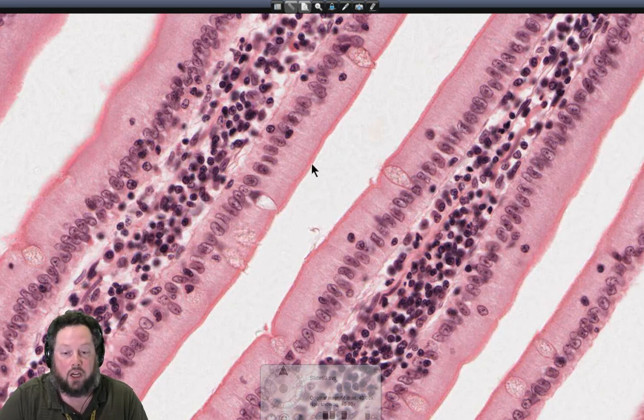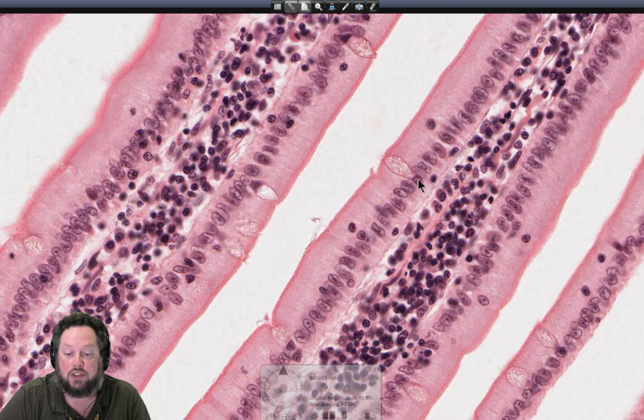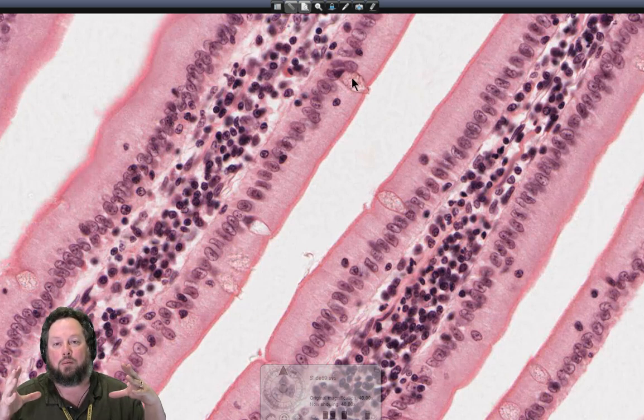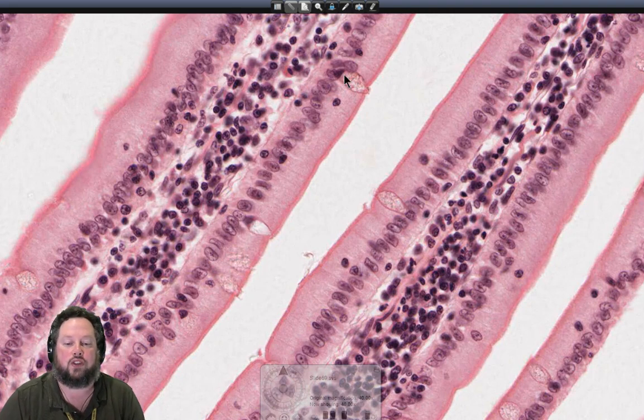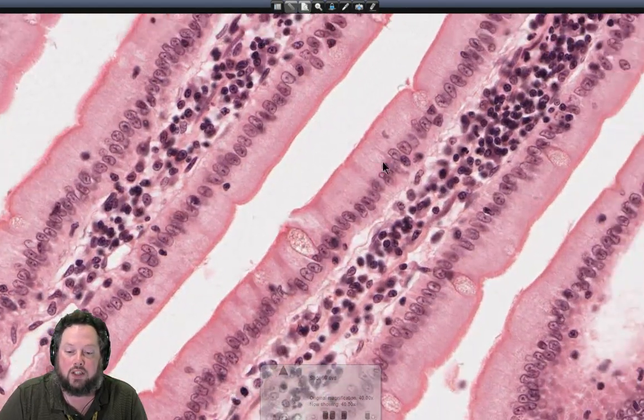The second cell type, which is very prominent here, is the goblet cells, and you can see them here. These are some really lovely sections of goblet cells. You can see the nucleus of the goblet cell and the apical pale staining region. These goblet cells have 1 to 2 secretory cycles during their lifetime. They undergo what's known as compound exocytosis, so all of their secretory organelles fuse together in one big clump and then exude onto the surface. You can see those as these pale regions scattered throughout. These are really nice here.